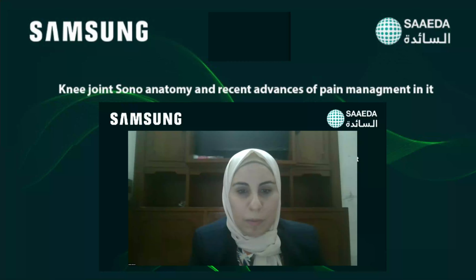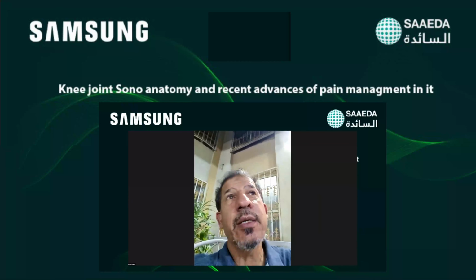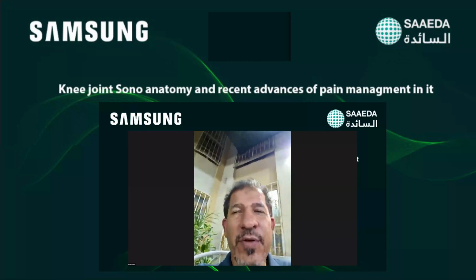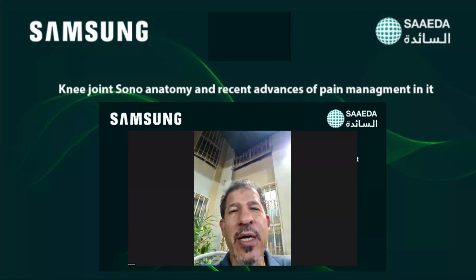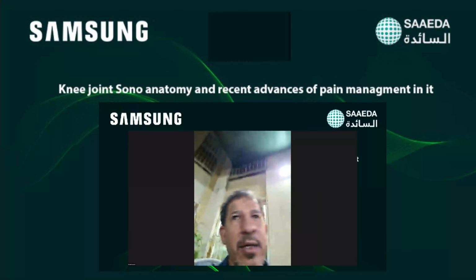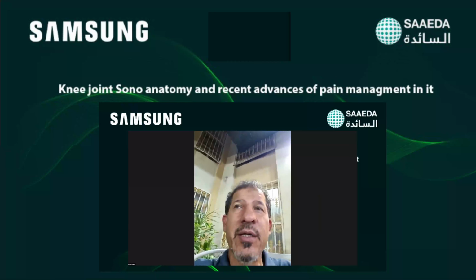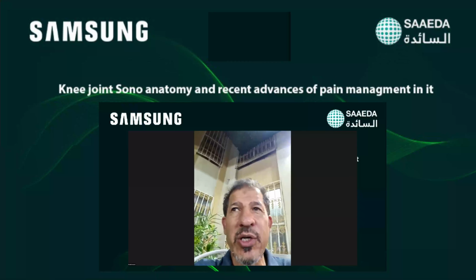Yes. Thank you. Because the guideline does not mention that. Yes, of course, there is no guideline. There is no evidence base about the use of intra-articular radiofrequency. And I think ablation of the nerve by ultrasound-guided radiofrequency is enough.